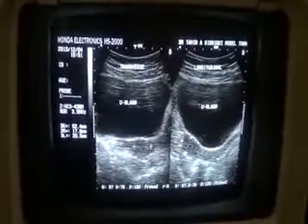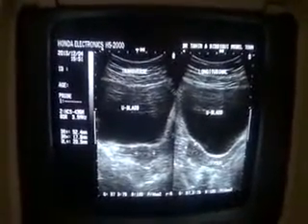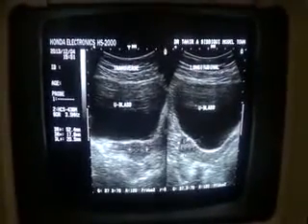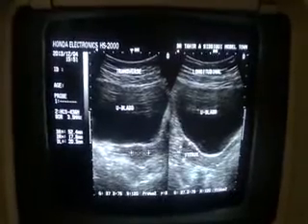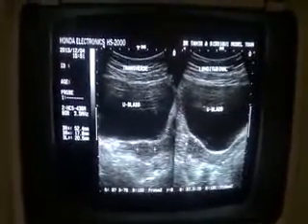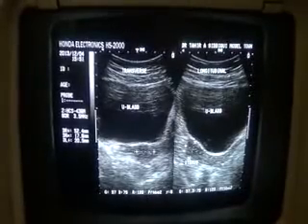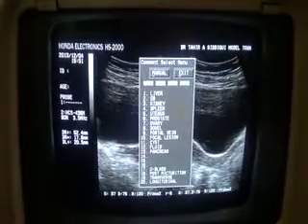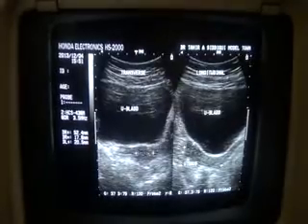The minimum required is 6 centimeters, and the patient's uterus measures 5.2 centimeters. In anterior-posterior diameter the uterus measures 1.7 centimeters, whereas the minimum required is 2.5, with the endometrial canal not visualized, just seen as a thin line.